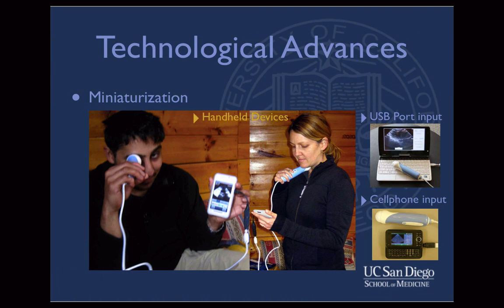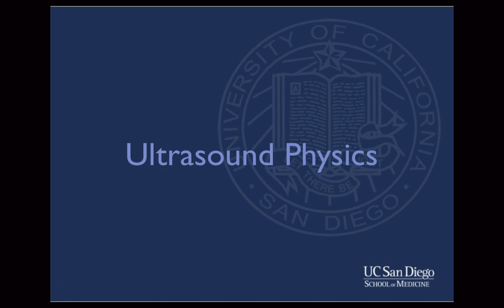Handheld ultrasound devices continue to be a focus of research and development for several manufacturers. Newer machines with improved resolution and increased versatility are expected to arrive on the market in the near future. Additionally, several ultrasound products are also newly available on the market which no longer require an actual machine. Instead, the transducer is able to directly connect to one's cell phone or laptop USB port, which contains software to view the real-time image.